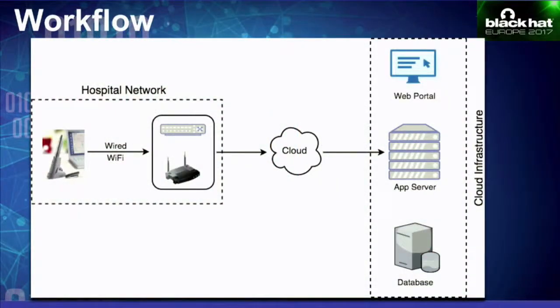Right. So I've tried to create the workflow for that particular device. It would typically be on a hospital network, connected to the hospital's private network using wireless or Ethernet. Once it captures data or the prescription, it breaks out to the internet using the hospital's enterprise gateway. Then that data is stored on the cloud. So there's cloud infrastructure, an application server, and a database server.